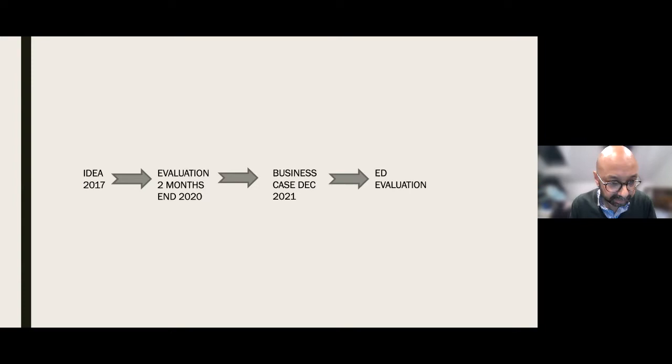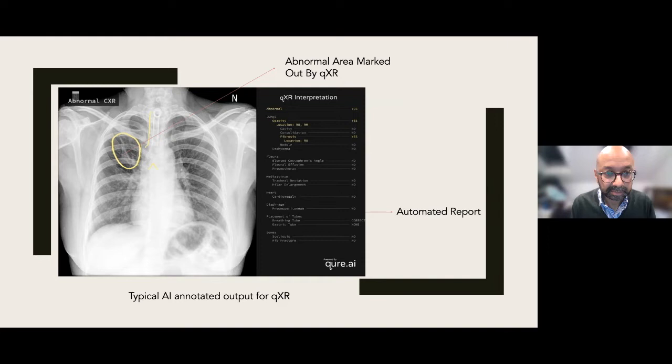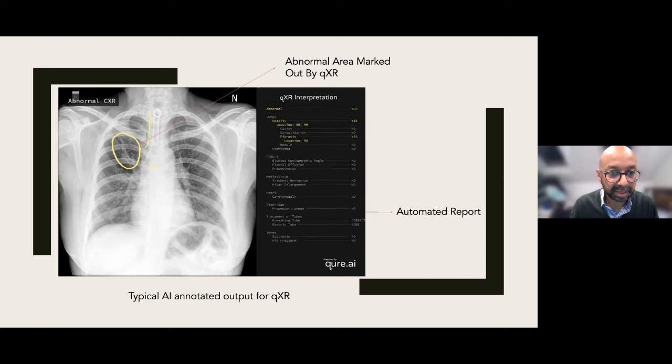So if we now go to my second slide, if we go back to the beginning. Yeah, second slide. So this was about chest x-ray evaluation software, and Harris showed a beautiful chest x-ray earlier. And you can see here how we're demonstrating that this software can pick up where there's a lesion. It could potentially list out the lesion almost instantaneously, which will help clinicians on the ground in the middle of the night. The idea was that we could prioritize a work list of chest x-rays into normals and abnormals for radiologists to then be able to attend to more quickly.